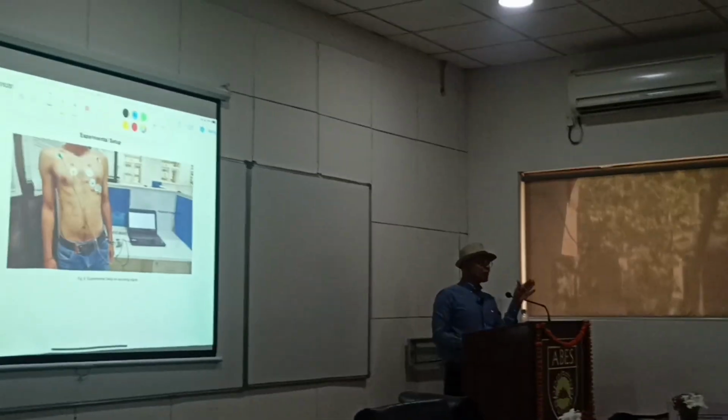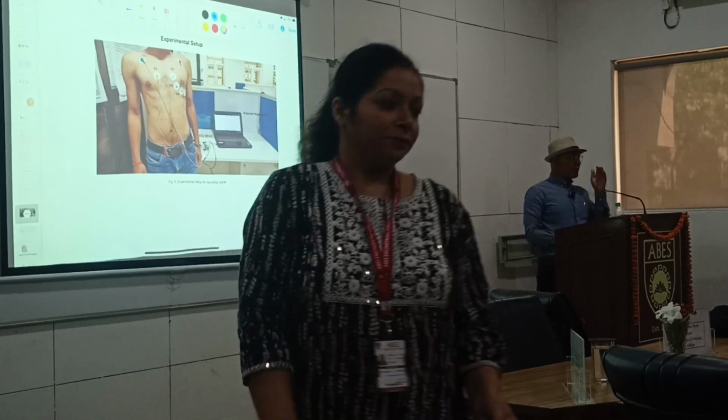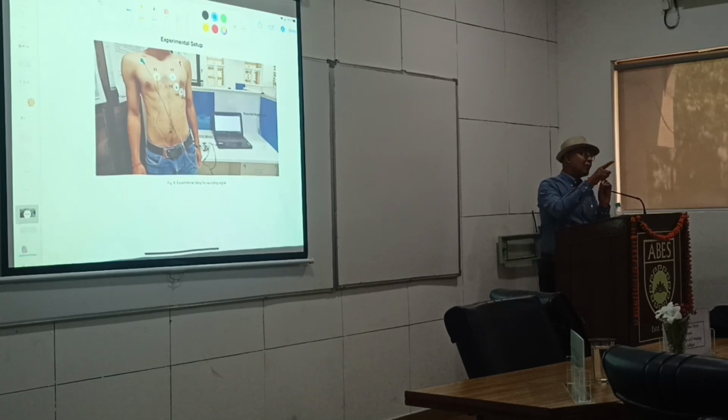Yeah. So what I was doing for V1 to V6, that is on the chest. There is no problem whether you take it sequentially or parallelly. There is no information loss. The problem arises when you are taking lead 1, 2, 3 sequentially. Since you need to have them parallelly, you have to find a mechanism so that the loss of this shifting can be compensated.